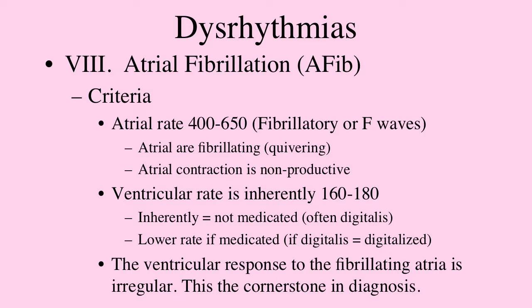Usually a patient is put on a medication called digitalis, and there are other possibilities too. The idea of digitalis is that it will slow the ventricular rate, so you'll have a slower ventricular rate despite the inherent atrial fibrillation. You can lower the rate down to more of a normal area. If you look at, for example, the third one down on page 57, or even the bottom one, there's quite a slow ventricular rate, and that's good. That's what you want to do, slow down the ventricular rate to the quivering atria.